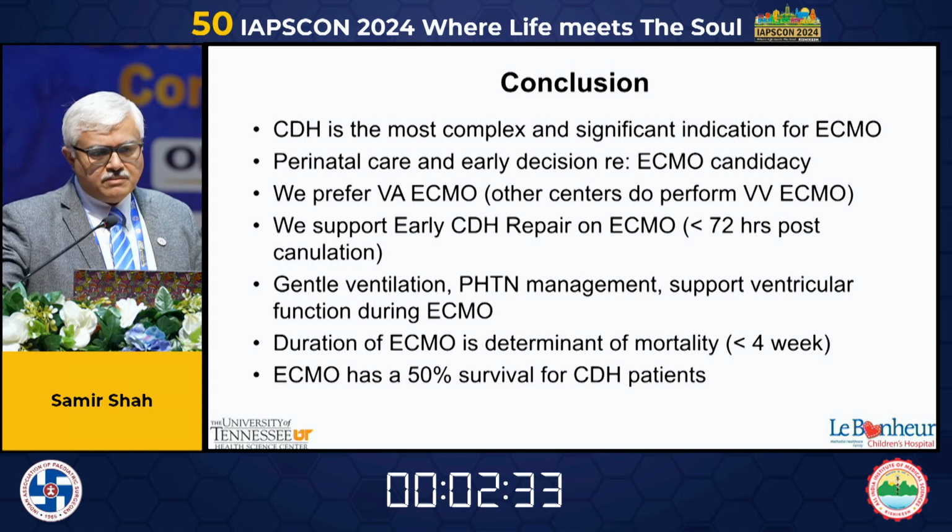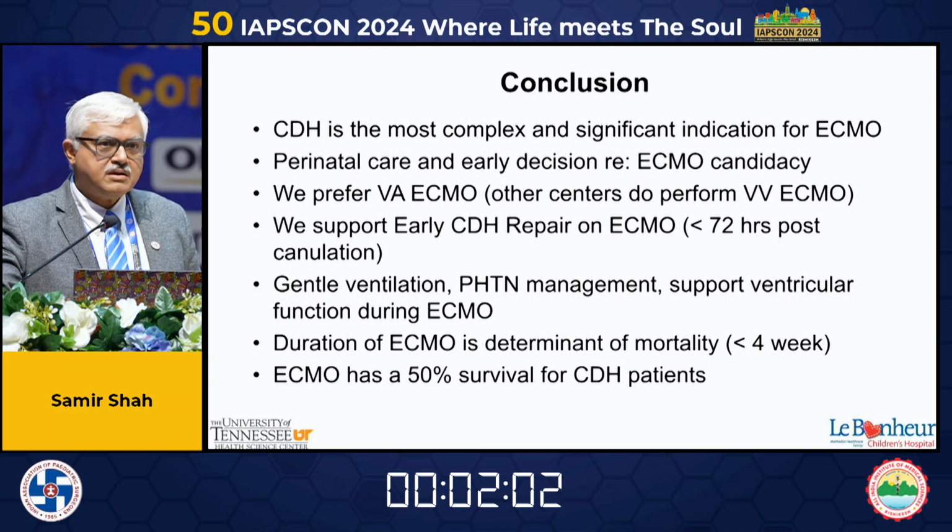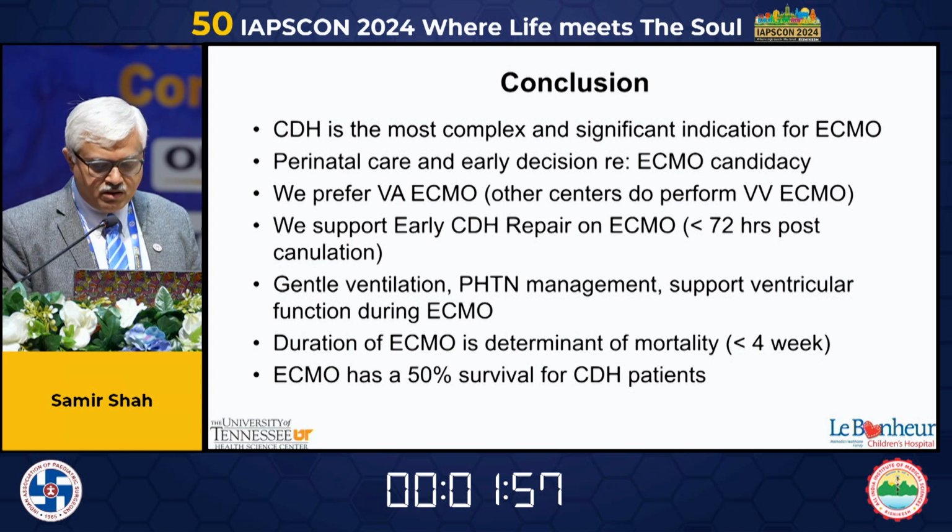So in conclusion, CDH is a big undertaking, and it's perhaps one of the most complex and significant indications for ECMO. Its perinatal care and early decision regarding ECMO candidacy is extremely important and has to be really well thought out. We prefer VA ECMO at our institution. We support early CDH repair on ECMO. We use standard management principles that are listed out here. The duration, as I mentioned, is the determinant of mortality. And even with ECMO, survival is at 50%. But these would be patients who would have died if you had not offered them ECMO.